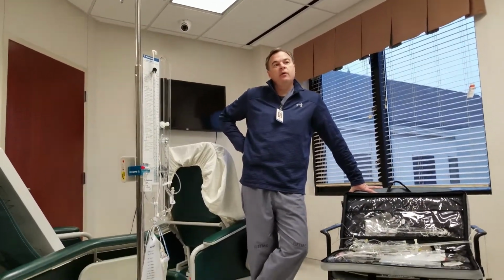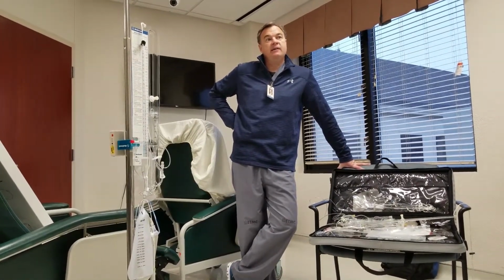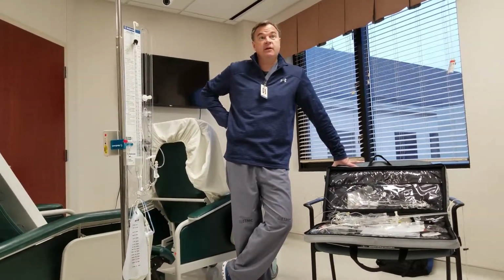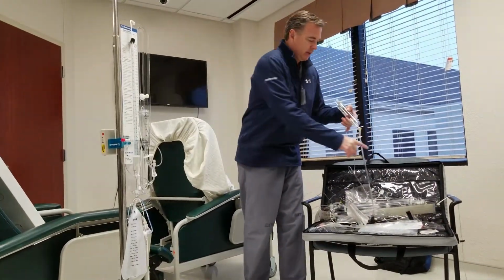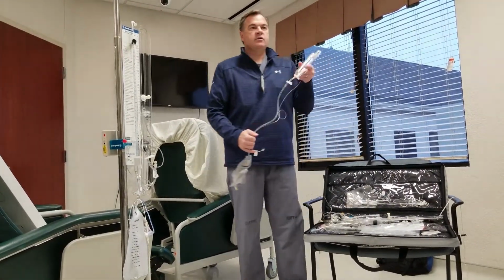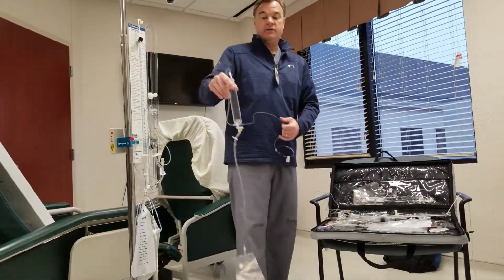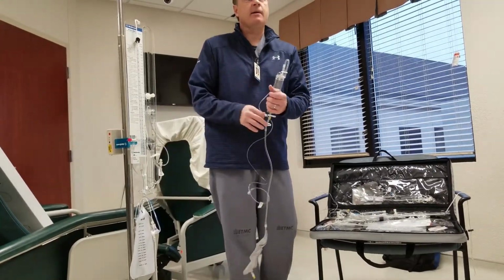That's more of a volume drain, where somebody's written the orders for volume, right? And then obviously you would want it closed, otherwise it's free flowing. In that scenario, when you're taking off volume, this is an old school volume one right here. There's no scale, there's no gradient, typically nothing else. You put it down here, and when it gets to a certain point, you just close the stopcock and away you go.